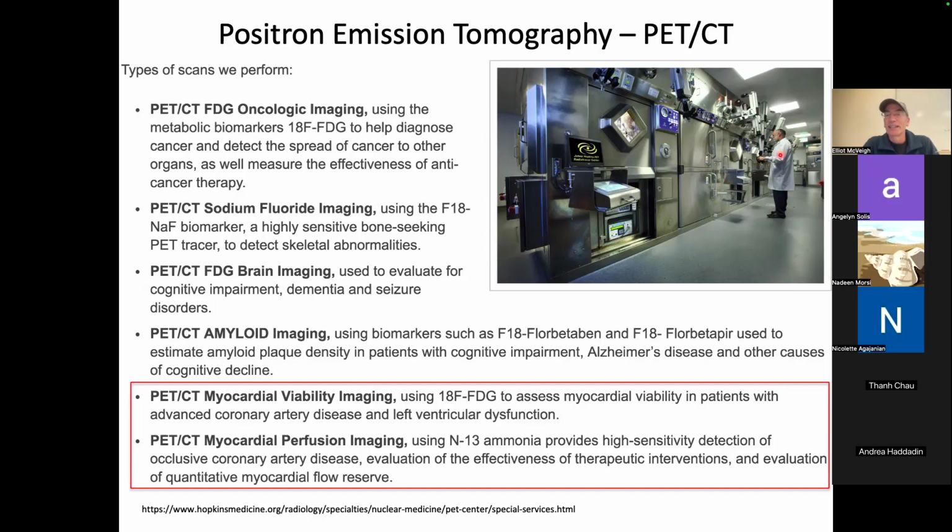And then getting it to the room, in some places they'll have a vial, gets tucked away with this sort of O2, like with oxygen 15 in it, water. And then they'll put it in a vacuum tube and it goes down the hall really fast and pops out the other side, and they stick it in the patient, right?